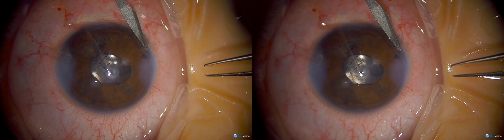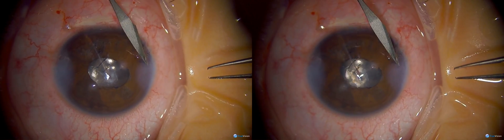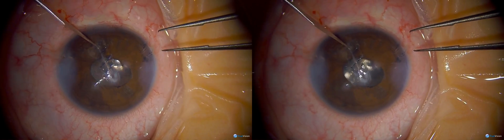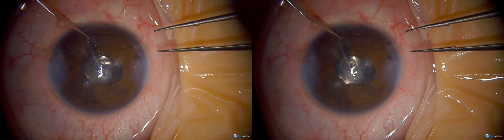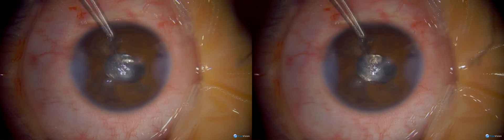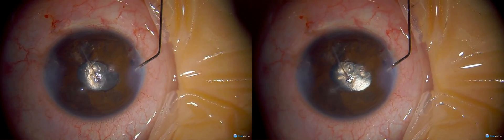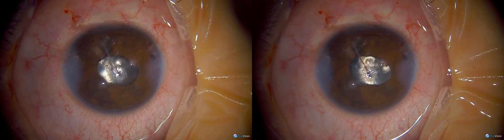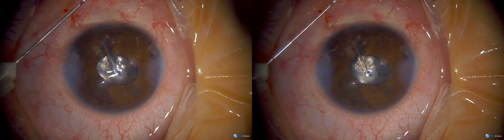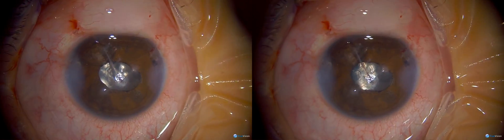She is five years old with a central visual axis scar, putting her at relatively higher risk for amblyopia, so we have to watch her closely. Once this clears in a couple of weeks, I will start patching her to make sure she doesn't start forgetting to use this eye. The sequence of a traumatic cataract was perfect here: repair the ruptured globe first, followed by lensectomy, then leave aphakic until you're ready to remove the stitches a month later. Now she'll have a nice secondary lens, we'll remove all the stitches, and hopefully this will be the last surgery she needs.